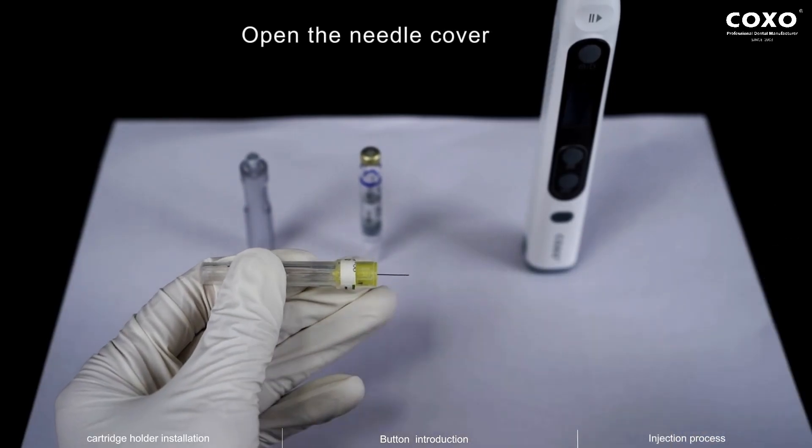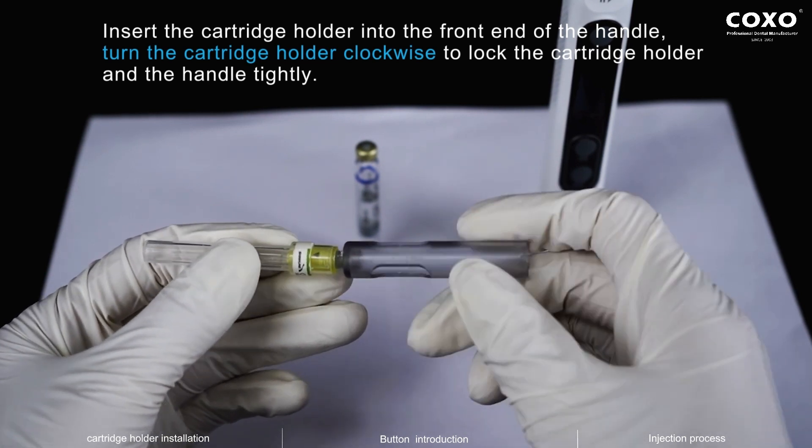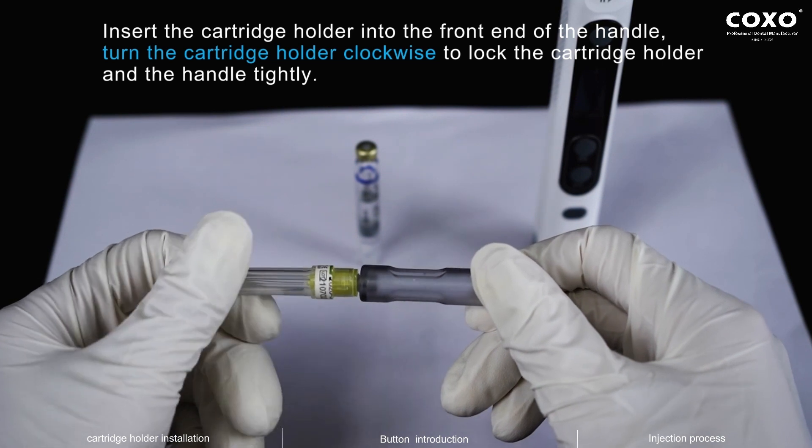Cartridge Holder Installation. Open the needle cover. Insert the cartridge holder into the front end of the handle. Turn the cartridge holder clockwise to lock the cartridge holder in the handle tightly.